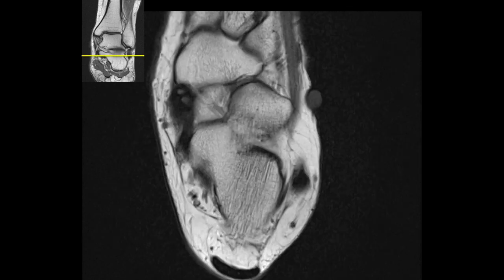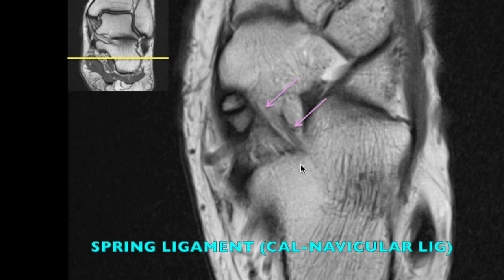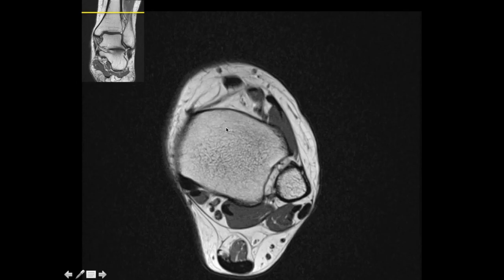Going further inferiorly, you can see a ligament bridging between the navicular bone and the calcaneum — this is the calcaneo-navicular ligament or the spring ligament. Other ligaments are better seen on the coronal images and will be discussed there.